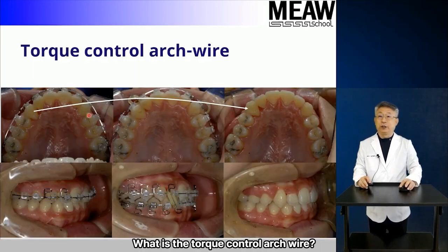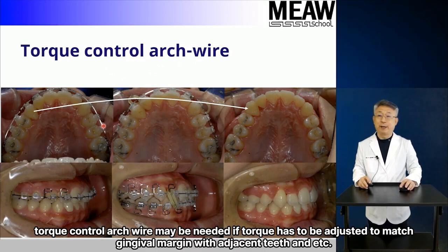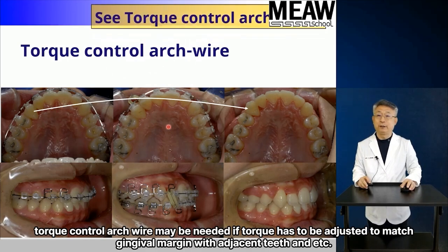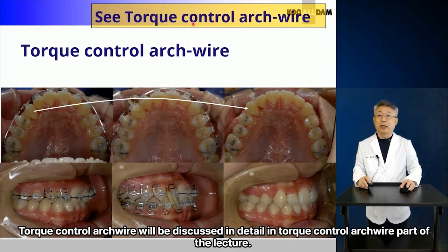What is the torque control arch wire? When a crowded tooth in the upper arch is aligned, torque control arch wire may be needed if torque has to be adjusted to match gingival margin with adjacent teeth, and so on. Torque control arch wire will be discussed in detail in torque control arch wire part of the lecture.